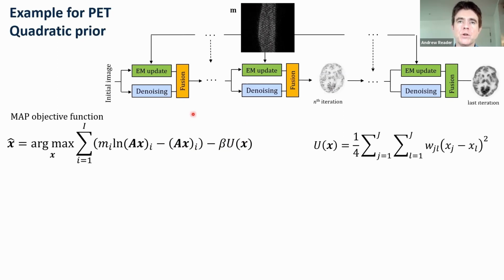When we take the log of the likelihood times that prior probability, we end up with this log posterior, which you can view as a penalty on the maximum likelihood. So that's the data fidelity, and then that's the penalty function for that data fidelity. In other words, get close to the data, but don't get so close as to generate noisy images. The prior I'm looking at looks simple, but for PET it is very difficult to implement and to get right mathematically. That's why it took De Pierro in 1995 to write a paper that managed to deal with this issue.